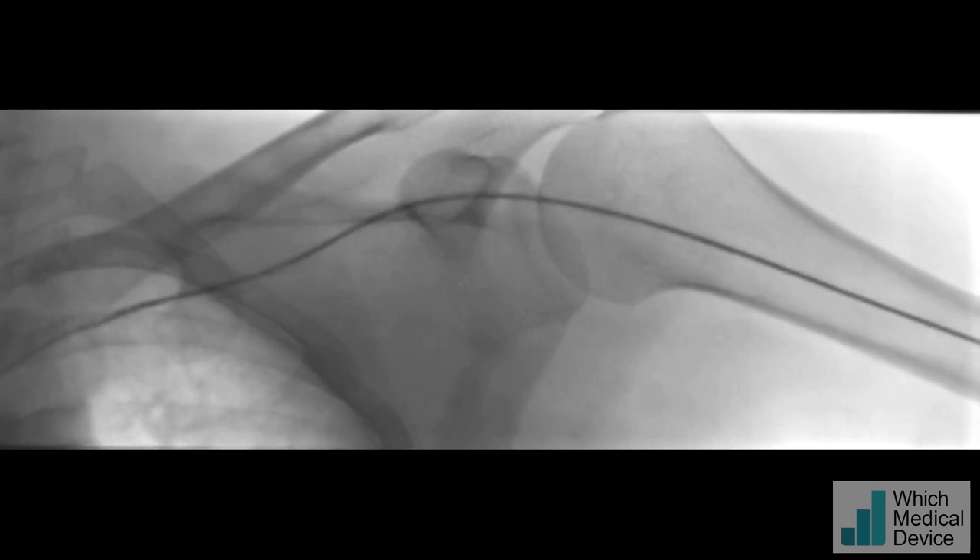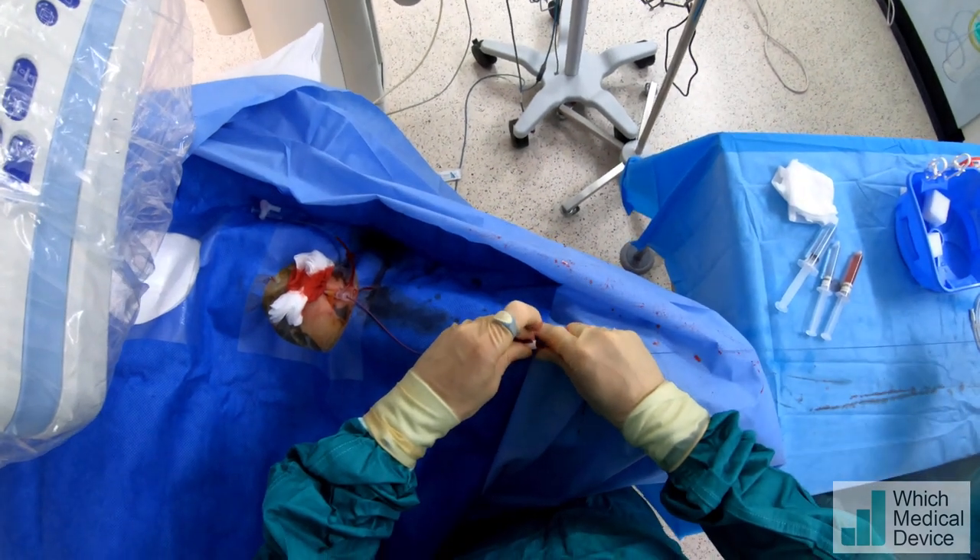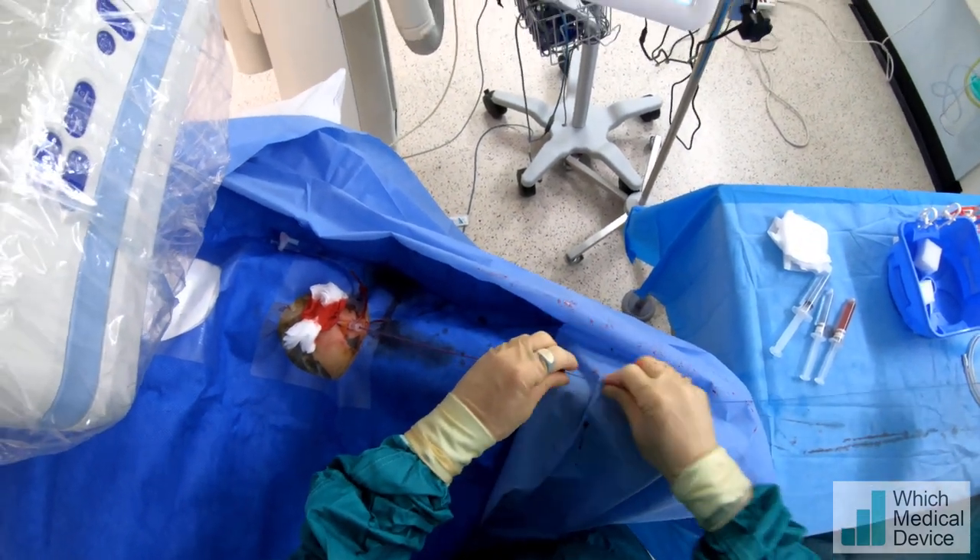I'm going to follow that with a catheter — just going to take the catheter around now. We're going to put a superstiff working wire in. I tend to do most plasties and stents over a stiff wire if I can — it just gives you more support.